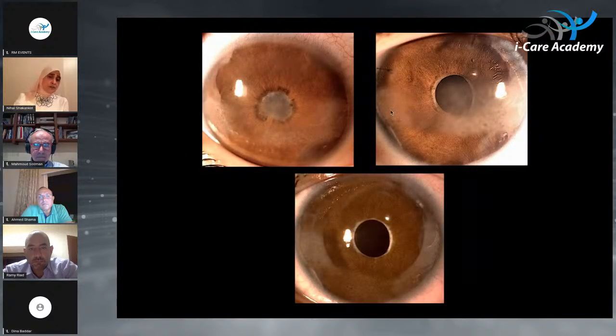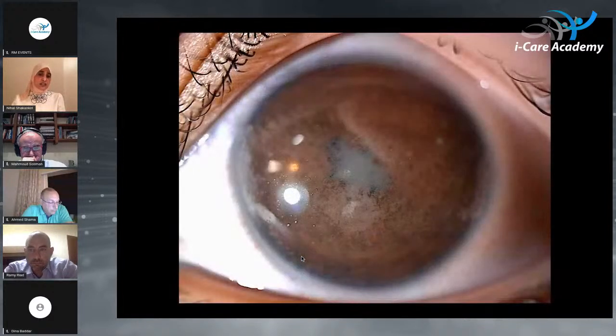And this is an eye with a severe case with complicated cataract, total posterior synechia, iris bombé, and you see here at the edge, iridocorneal contact and band keratopathy. Here, a few weeks after surgery, and still with the band keratopathy. And here at the final result, 1 year after surgery, you have a clear cornea because she had a chelation. We have a deep anterior chamber, clear visual axis, no sign of inflammation, and the pressure was controlled.